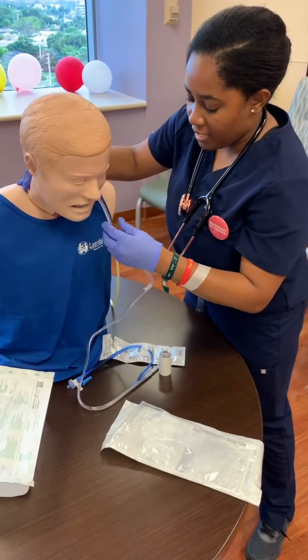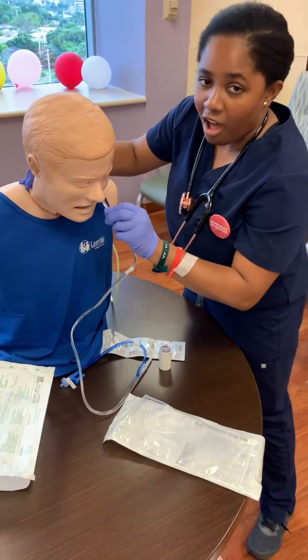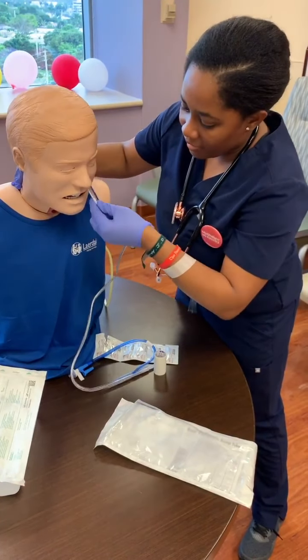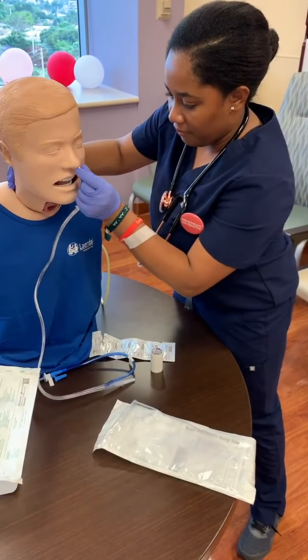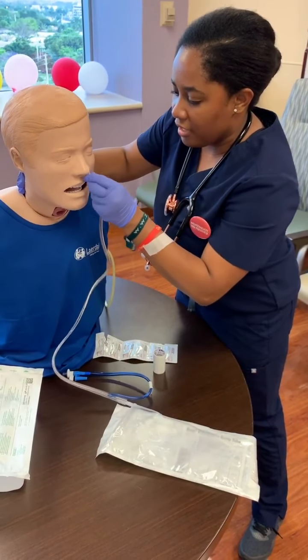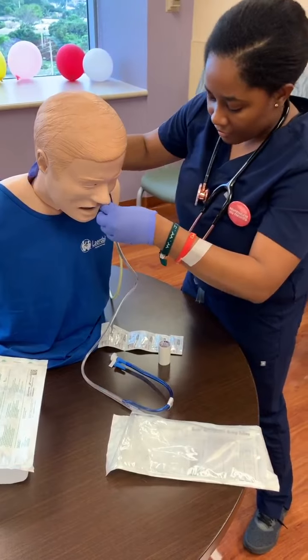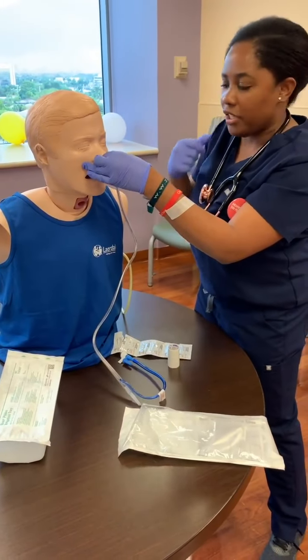It really can be very hard to put in. And of course, you're going to watch the patient to make sure they're not coughing, they're not turning blue, there's no signs of discomfort. It's a mannequin so it's not going to go in as easy, but we're getting there. I'm assessing my patient, looking at them to make sure they're good. So there we go — it's in. Now at this point, checking the mouth to make sure there's no coiling of the actual tube behind the patient's throat.